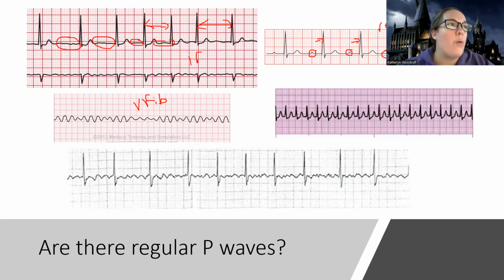This is what I was talking about: if you have a skinny QRS, but I can't see any Ps. People always ask, how do you know this is a T wave? It's just because of how it comes off of the QRS. With these rhythms, the T wave never really disappears unless you have a really bad rhythm, like a ventricular rhythm. But the P wave can disappear if my heart's moving super fast. So I have a whole bunch of QRSs, they're skinny, it's fast, but I can't see the P wave. So here, this is most likely SVT. And if you're sitting there wondering how I'm doing this so quick, remember, we're going to go through and do some practice together. More so here, I just want you to look at the P waves.